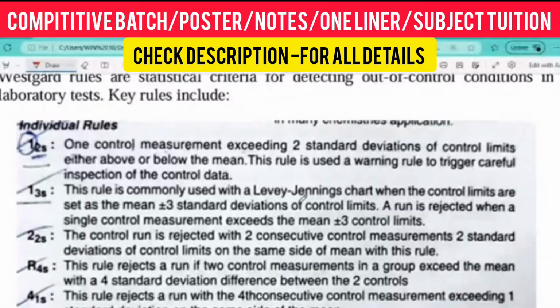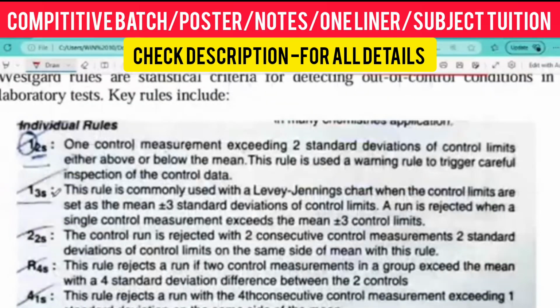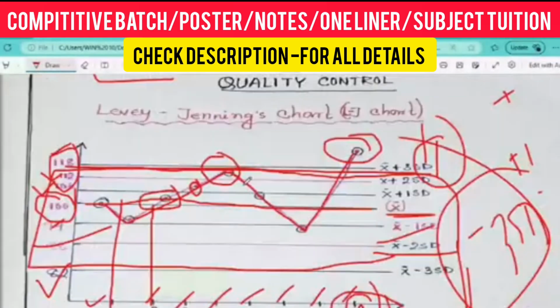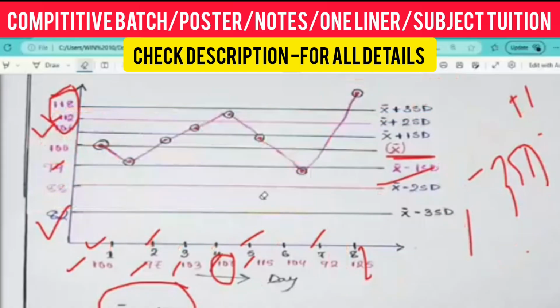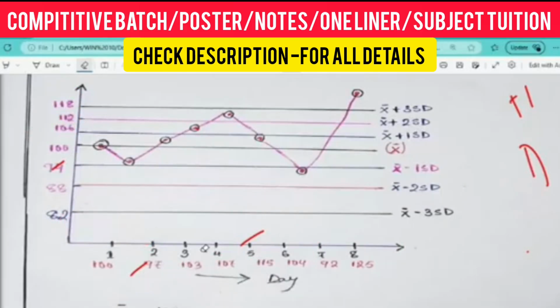Westgard multi rules. One control measurement exceeding the control limits above or below the mean is the warning rule, which triggers careful inspection. I'm erasing this part so that I can explain it easily to you. Please memorize these Westgard rules. I will not be able to say it again.